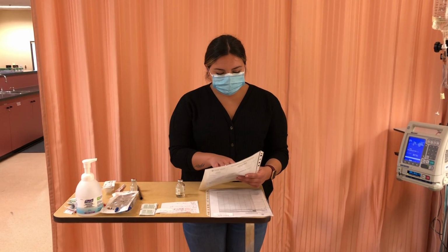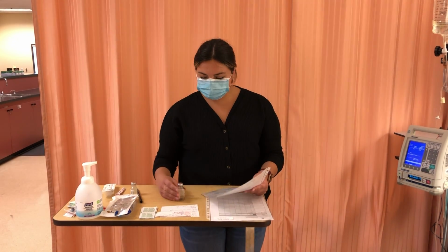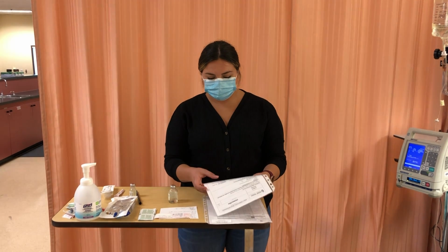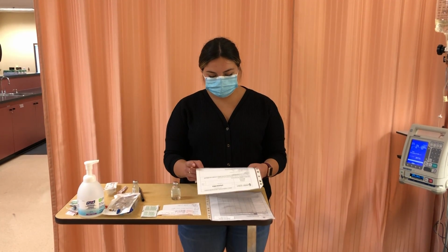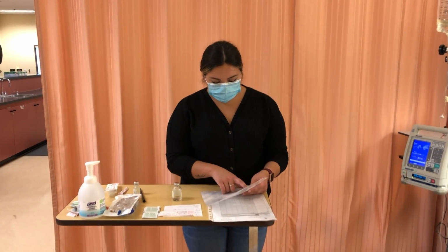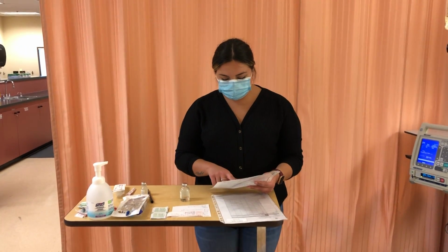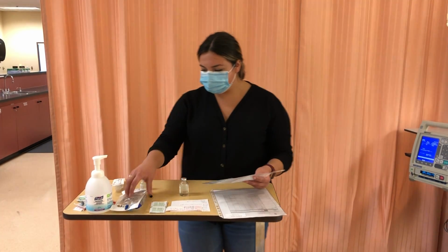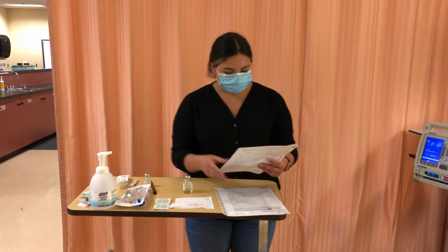So reconstitution, it is supplied as 500 milligrams, 1 gram, or 2 gram vials. We have a 2 gram vial, so I'll be reconstituting with 6.8 milliliters of sterile water for a final volume of 8 milliliters and a final concentration of 250 milligrams. For a 1 gram dose, I'll need to dilute in a 50 milliliter bag of normal saline and administer over 30 to 60 minutes. So I've got my 50 ml bag of normal saline.